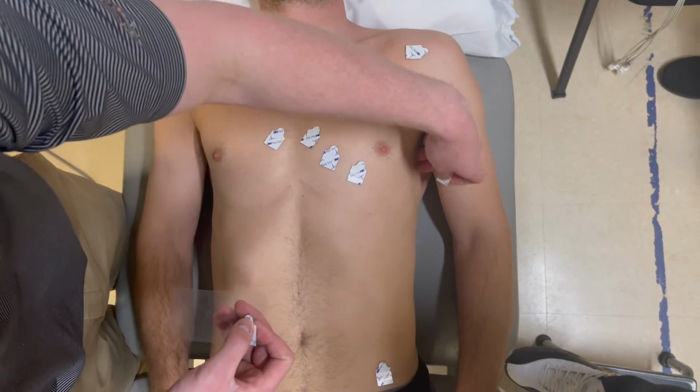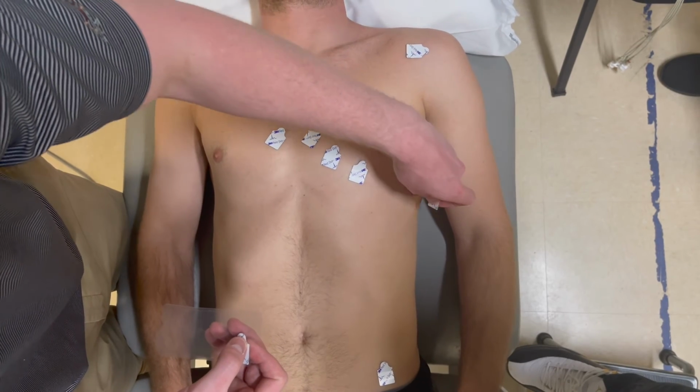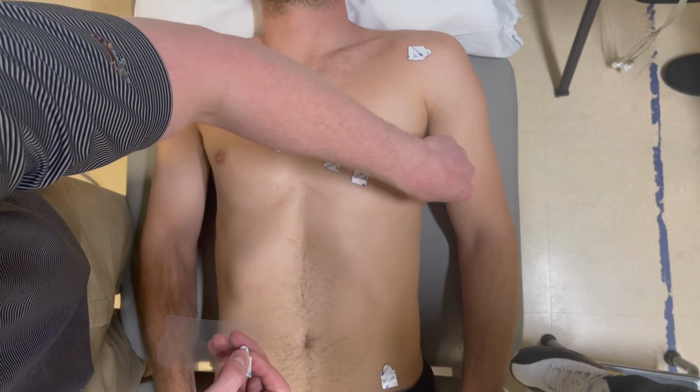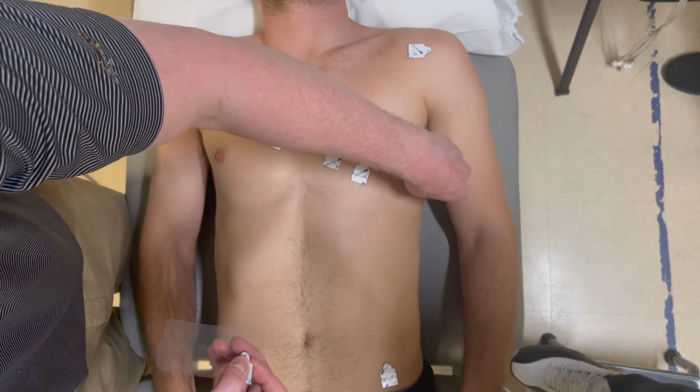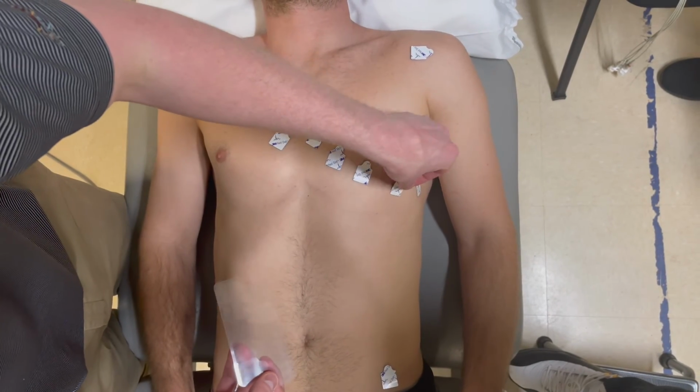We will also skip V5 and place V6 at the mid-axillary line at the same level as V4. And then finally, we will place V5 between V6 and V4.